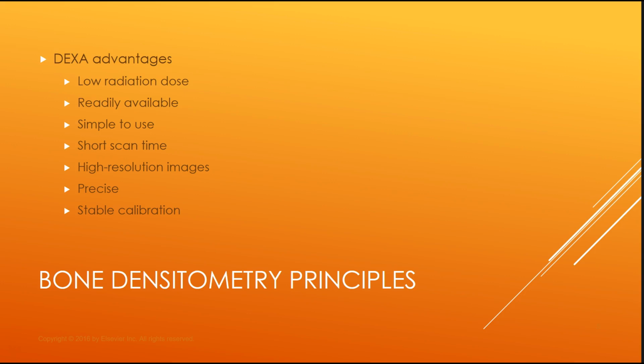It is readily available. DEXA scanners are everywhere. They are simple to use for qualified techs, and usually these are run by technicians. Short scan time: they used to be 5 to 7 minutes long, and now they're shorter than that. There are high resolution images, although we do not use DEXA images for diagnostic imaging, not ever.